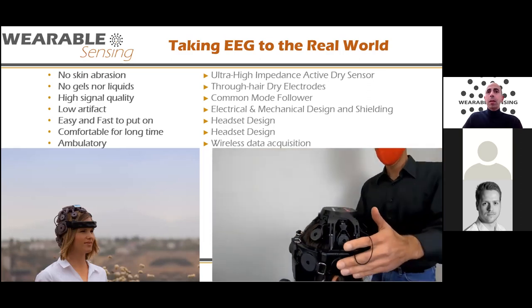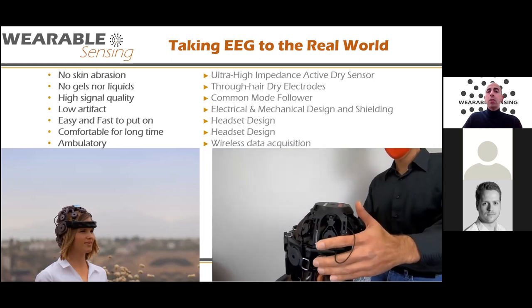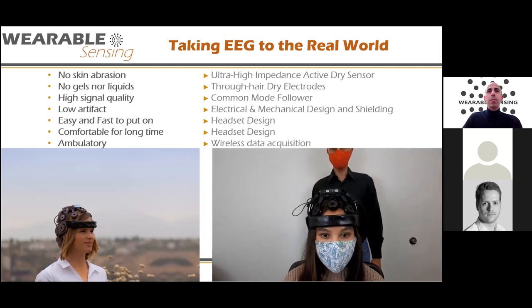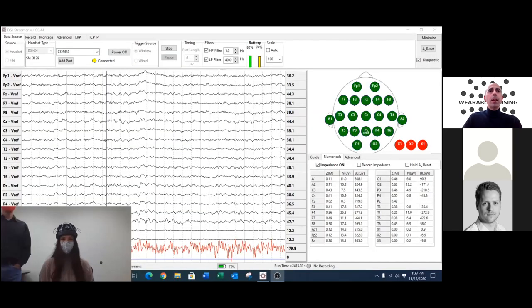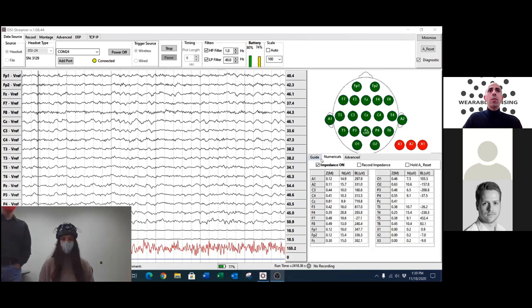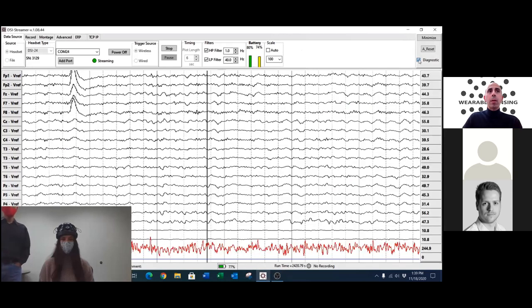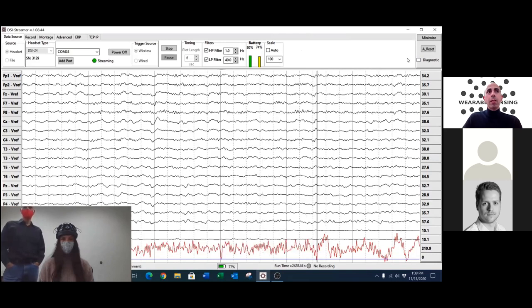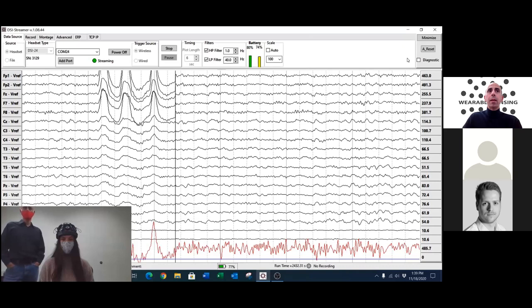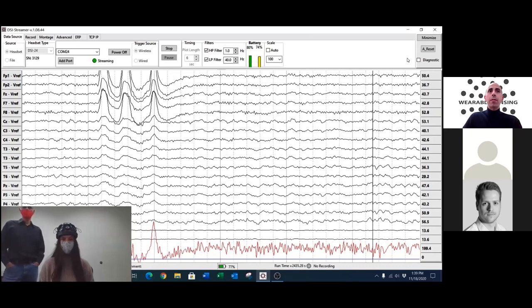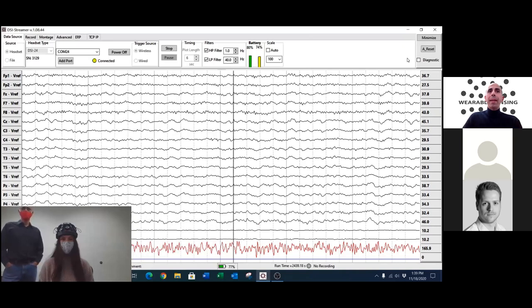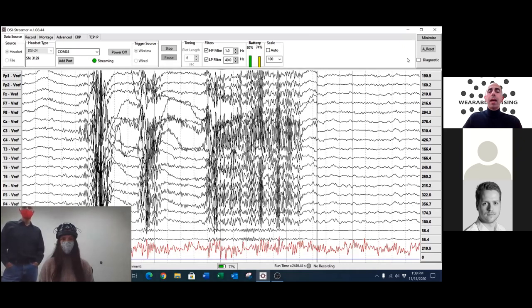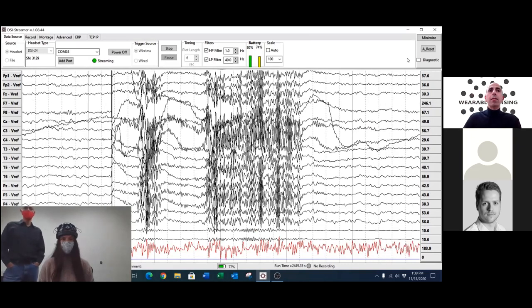Here you can see me putting the headset on a subject with long hair, working sensors through the hair with a tool — the whole process took about three minutes. Now watching the signal quality: she's sitting with eyes open. You can see what a blink looks like in the EEG. Now she blinks three times in a row — showing up in the front channels.